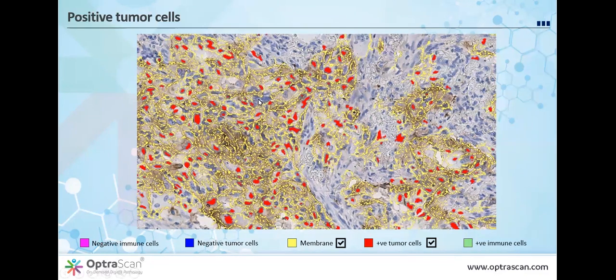Then what are they? Well, now I start thinking the 70% positivity that I assumed at the start might be a little off. My assumption was completely based on the consideration that everything within the membrane would be red. Well, if that's not tumor, then what is it? Let's find out.